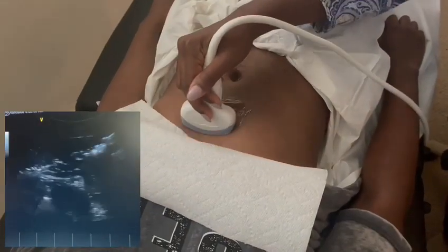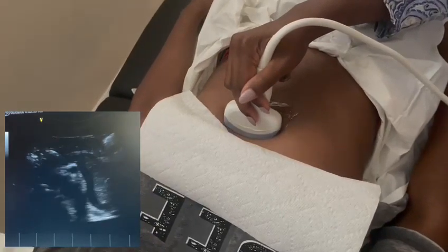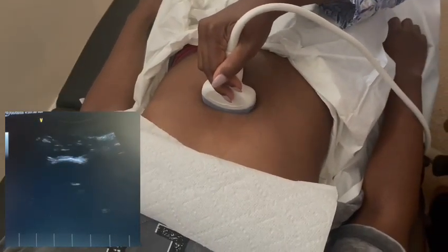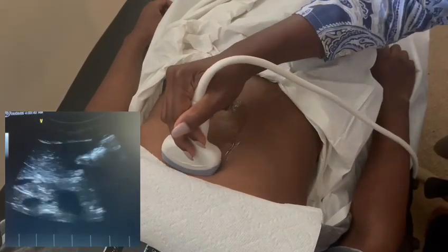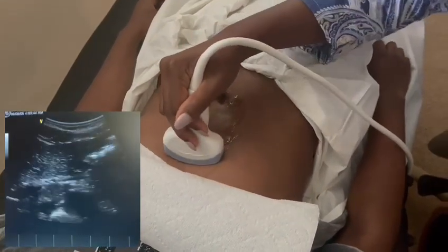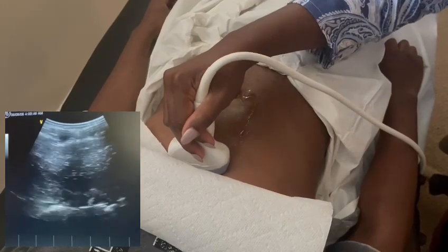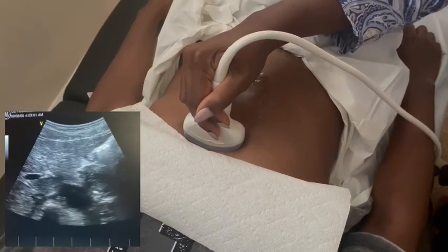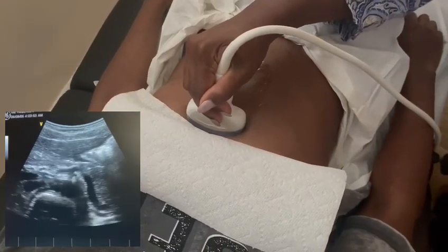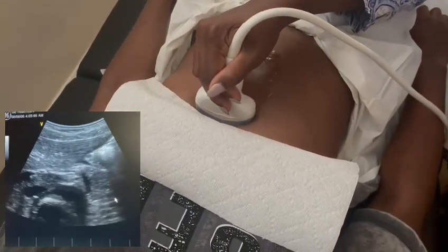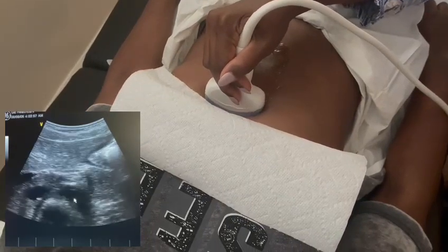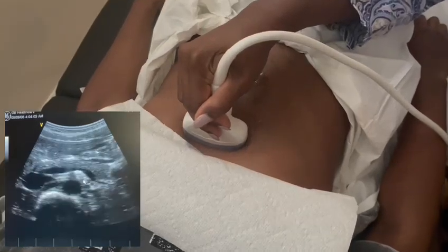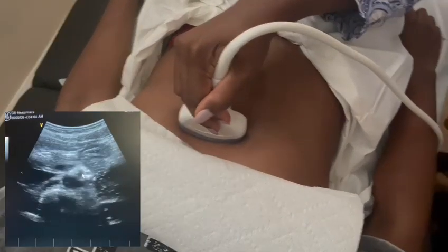We're looking at the abdominal aorta today. We'll start from the proximal — right now I'm just doing a quick sweep down and adjusting my gains. Deep breath in and hold it, please. She's taking in a deep breath and you can see that proximal aorta right there. I'm just going to start sweeping. You can see the celiac take off with that breath, and you can see the SMA begin taking off right there.